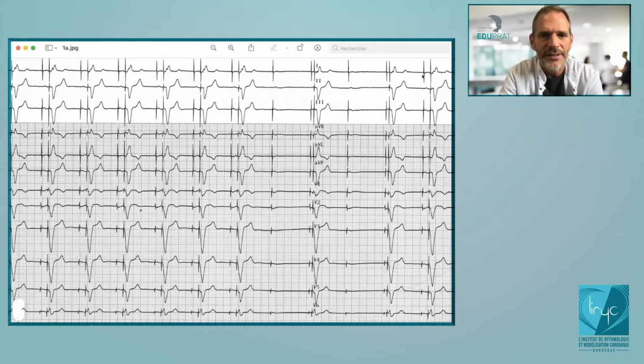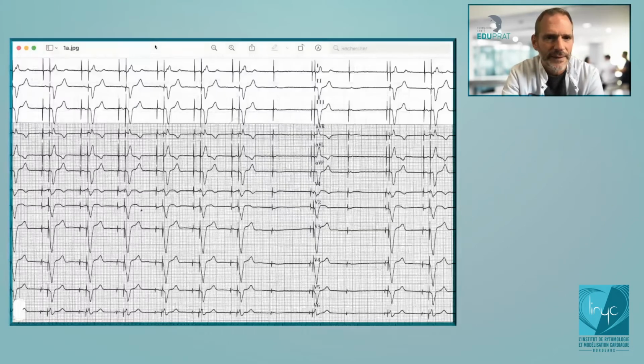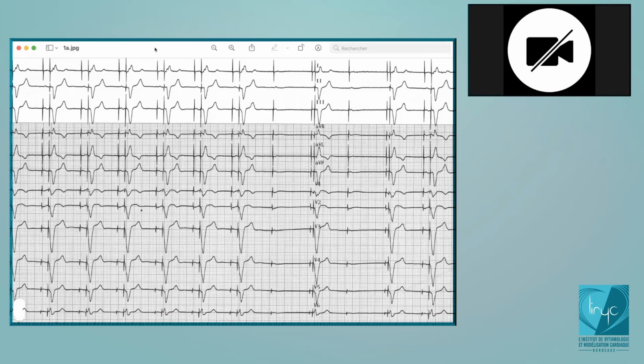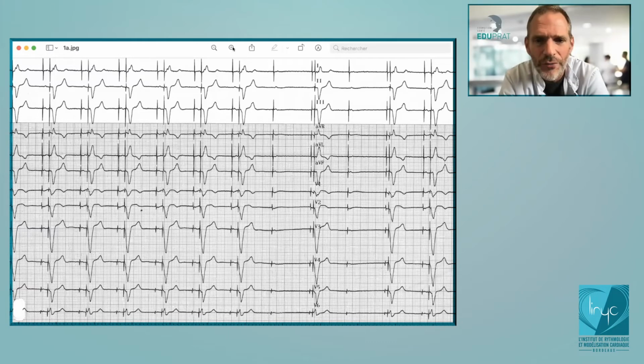If I show you this, is this a new or old Medtronic device, according to you? That's the old version of the MVP. So it was very simple.